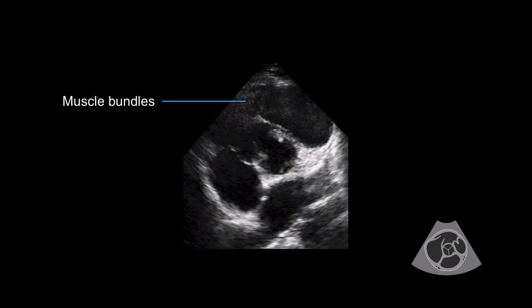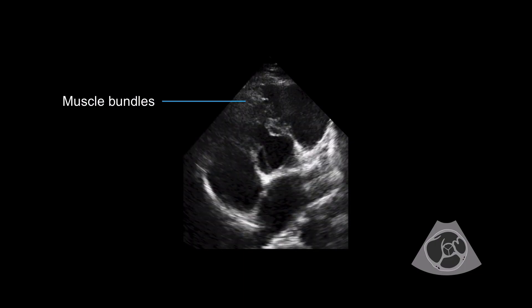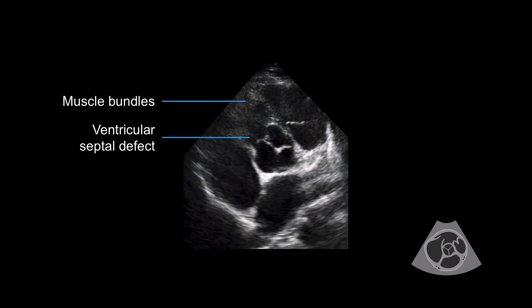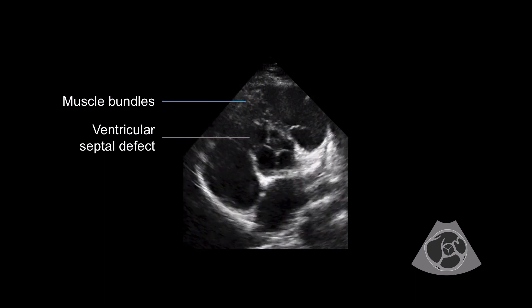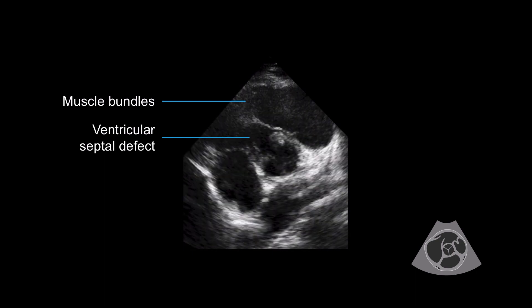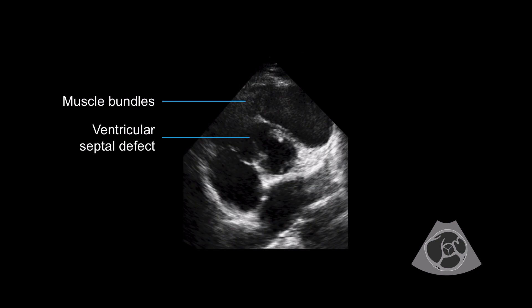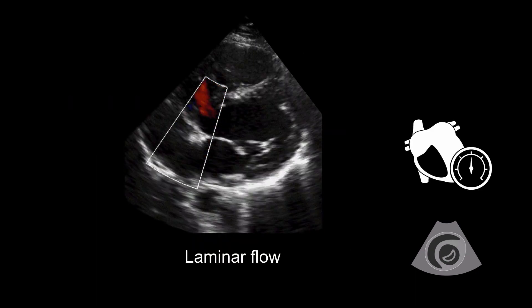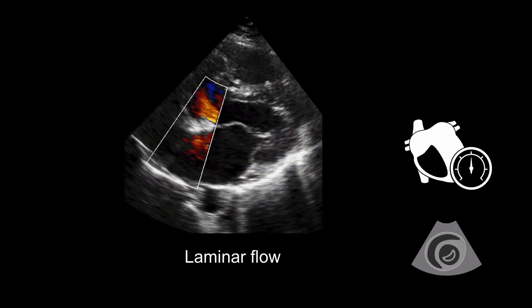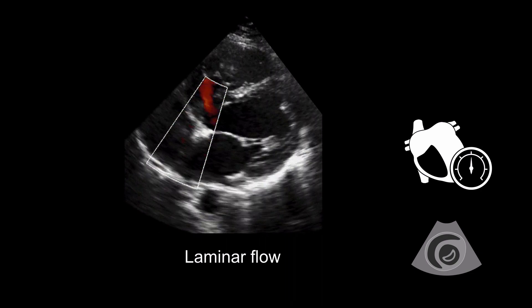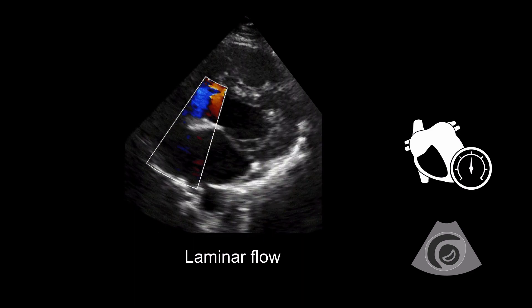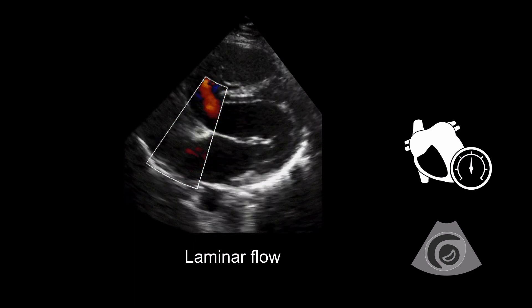On 2D imaging we can see the muscle bundles obliterating the outflow. Notice the ventricular septal defect — it enters into the right ventricle before the bundles, so entering the high pressure chamber, we can expect that it will be a low velocity. Here we see the red color flow across the ventricular septal defect but it doesn't look turbulent like VSD jets normally do. It's quite laminar, suggesting that the right ventricular pressure is high.